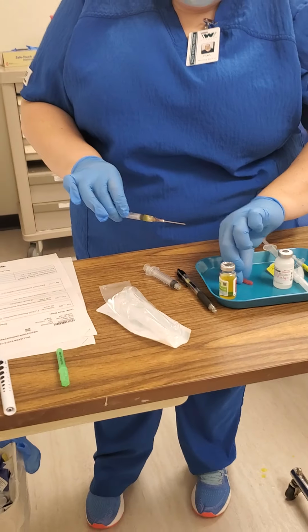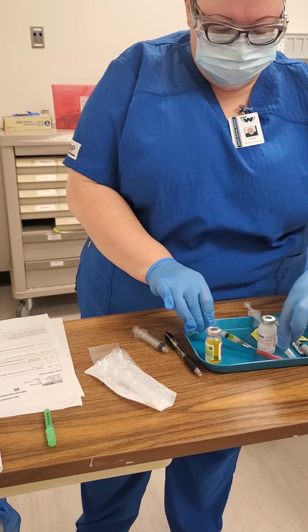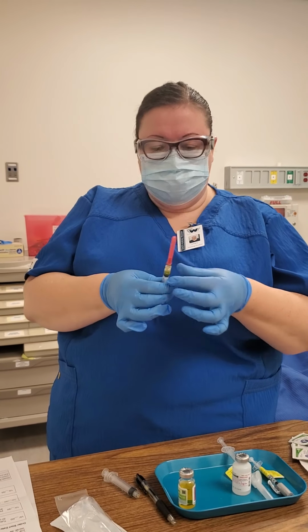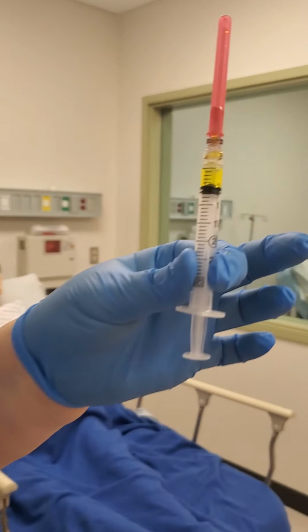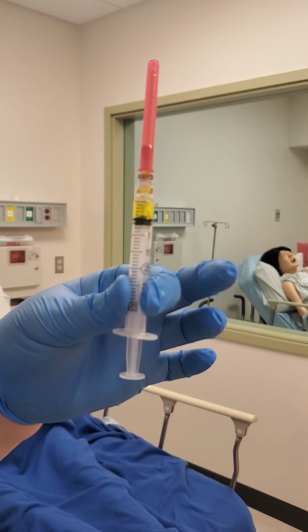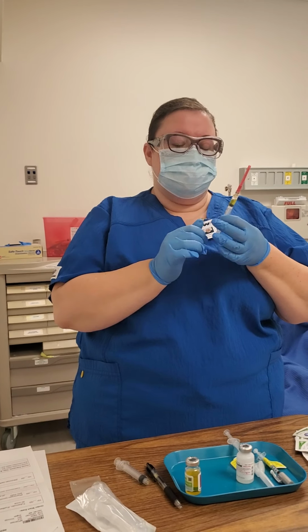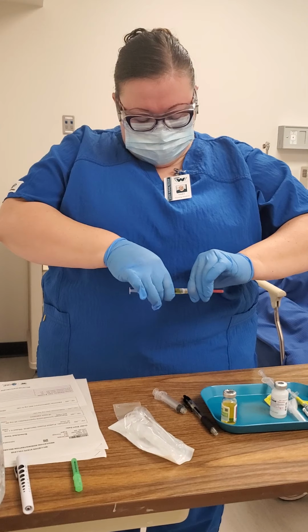And then we'll recap that. And then I'm just gonna show you that I have the 0.5 in there. Then I'm gonna draw back a little bit on that so that I can switch needles for the injection.